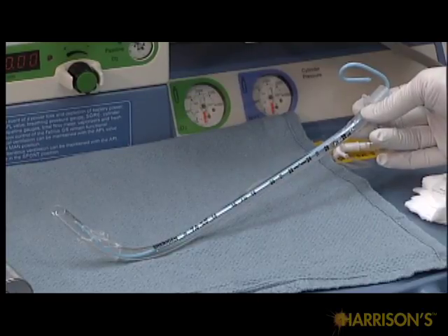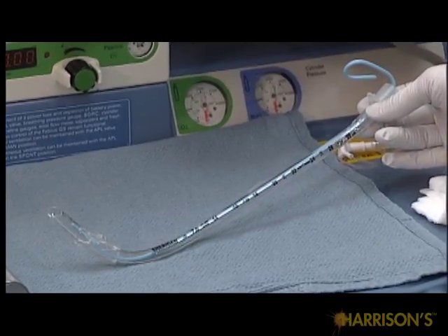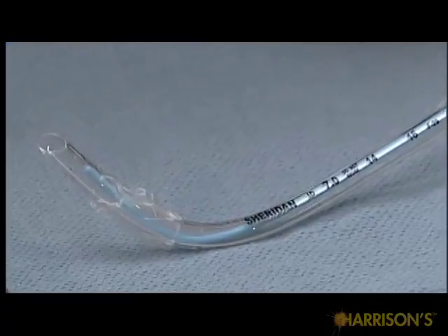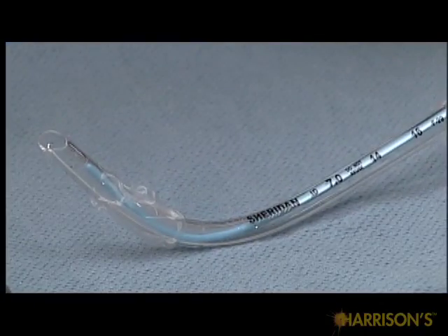The stylet should be inserted in the endotracheal tube and bent into a hockey stick shape to facilitate passing the tube through the vocal cords. In addition, it is important to ensure the stylet does not protrude past the end of the endotracheal tube in order to prevent tracheal injury.